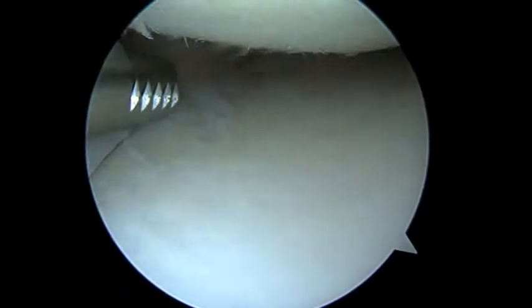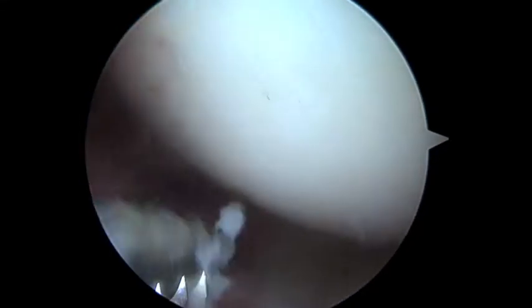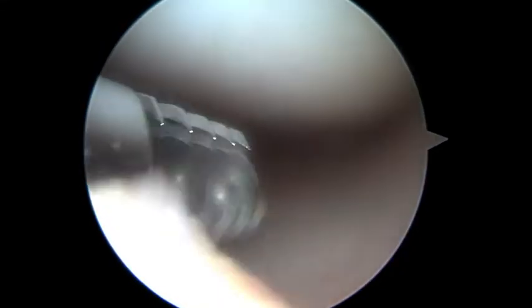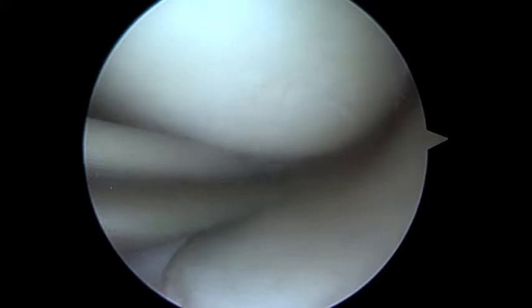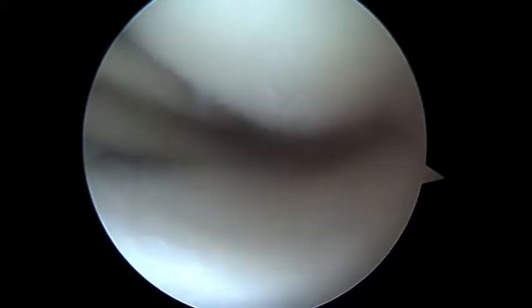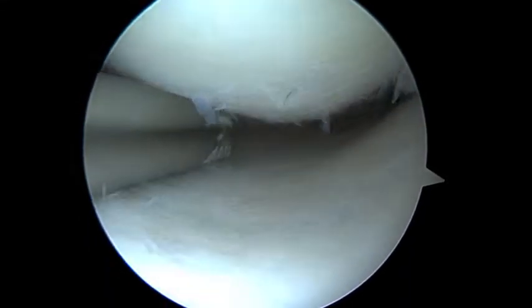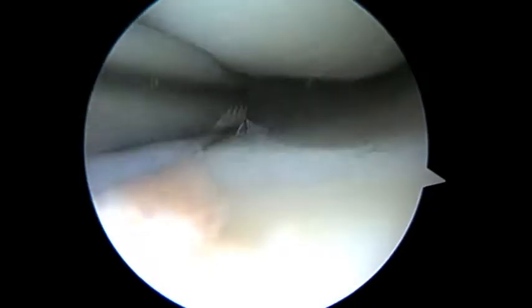Now we're just looking at the medial compartment. So far so good — I don't see any significant injury to the cartilage that we're looking at here. This is the medial side, the inside part of the knee. The meniscus looks good here, all the way through the body of the meniscus.